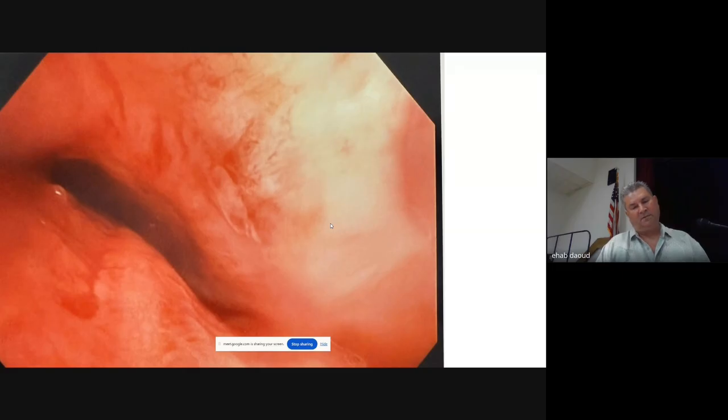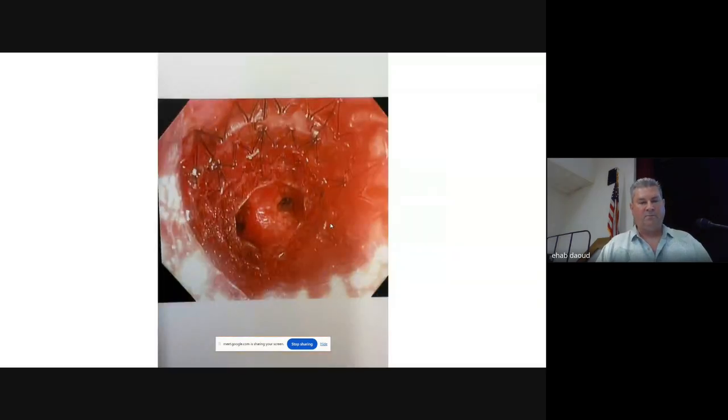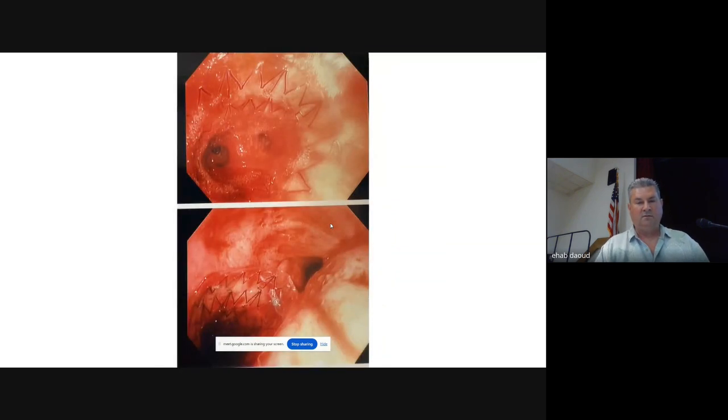So he had respiratory failure and a compromise of his left main. Basically, whenever he exhaled, the whole thing would just collapse. So we put telescoping stents. This is the distal stent after some ballooning, and then the proximal stent. And finally, at the bottom, you can see the final stent at the level of the carina.